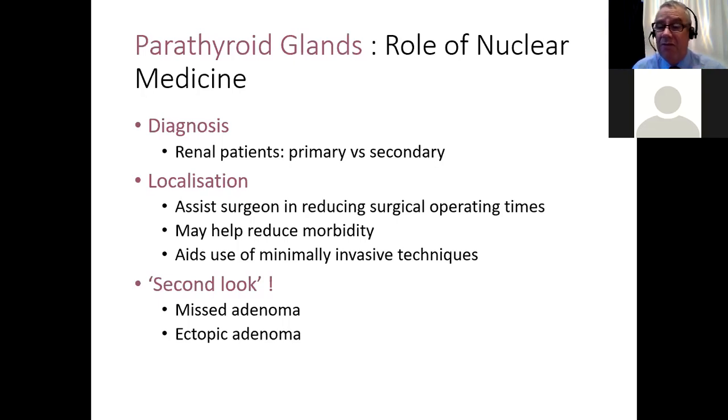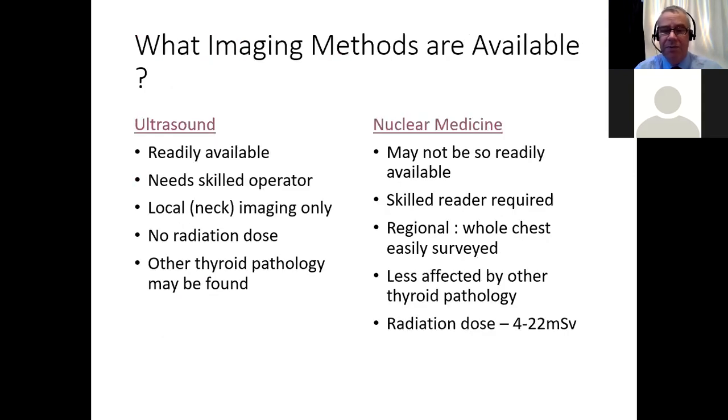And they can use minimally invasive techniques, which means that they're not quite a day care, it's often a 1 or 2 day operation. The other time we get asked to do it is when they've done the operation and the patient's calcium and parathormone hasn't decreased. That's either because they've missed the adenoma or it's an ectopic adenoma. Now, by doing good imaging beforehand, we should try and reduce the need for these second looks.